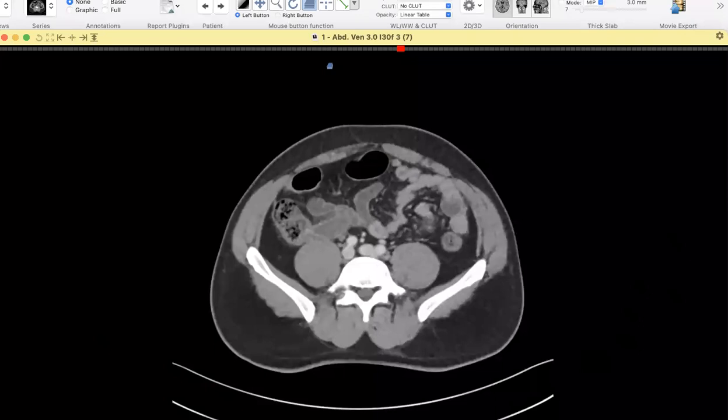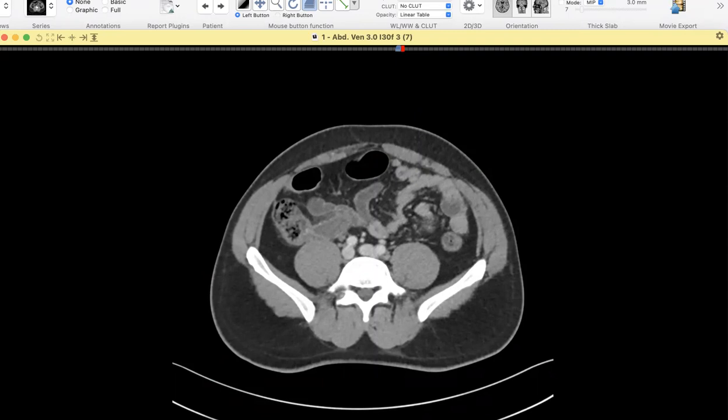So if you say it's a mucocele, is there a size criterion to differentiate between normal routine appendicitis versus a mucocele? A normal appendix must not exceed 7 millimeters. If more than 7 millimeters and surrounded by inflammatory changes, I would suspect appendicitis. I think mucocele is above 1 centimeter.